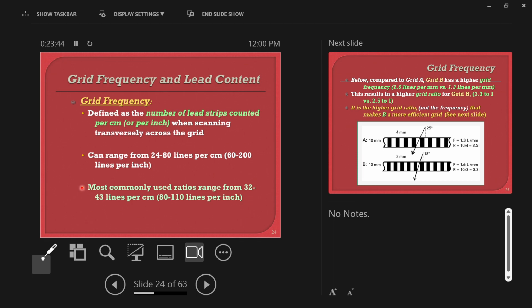And then after you're done testing, you're out there as a practicing x-ray tech, grid ratio is the only thing that matters, okay? Because the ratio is what actually affects the effectiveness of the grid, and all I need to know is a 12-to-1 grid is going to absorb more scatter than an 8-to-1 grid. So I need to know which one should I use, right? And here's the other tip and trick, you're probably only going to have one. You will have an 8-to-1 grid or a 12-to-1 grid.